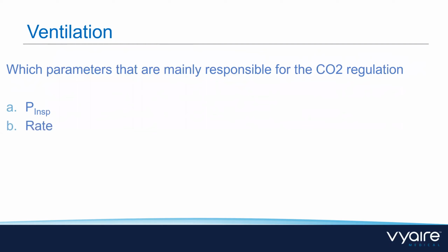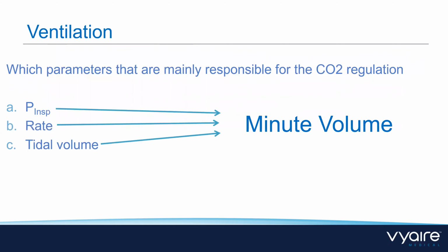This is the rate, and there is also tidal volume when you're on a volume controlled or on an adaptive target mode. So that means these are the parameters for minute volume, and minute volume defines CO2. And looking at I2E, FiO2 or PEEP, these are responsible for oxygenation, and this is managed in the same way as in any other mode.